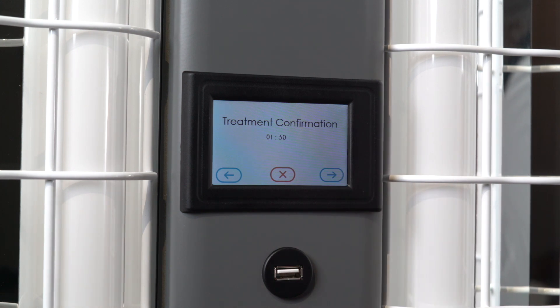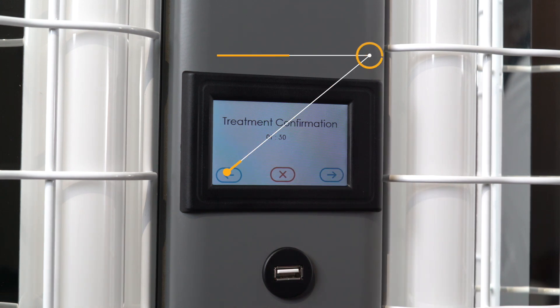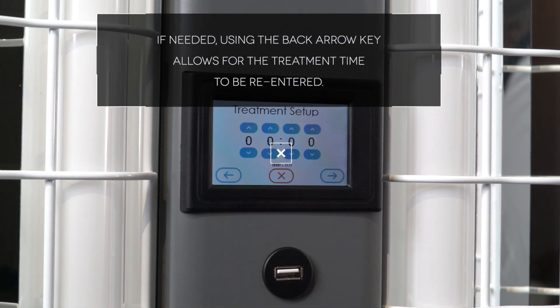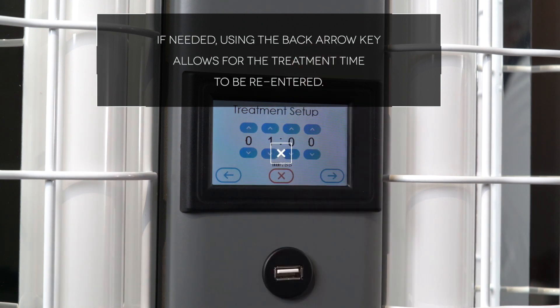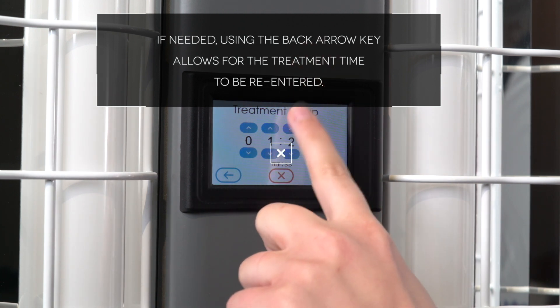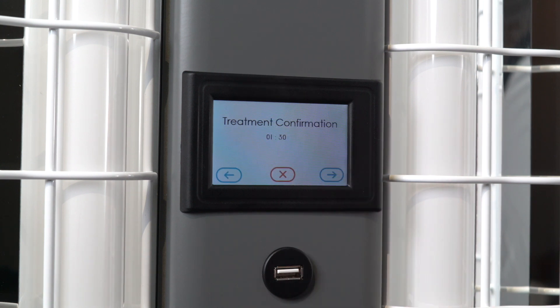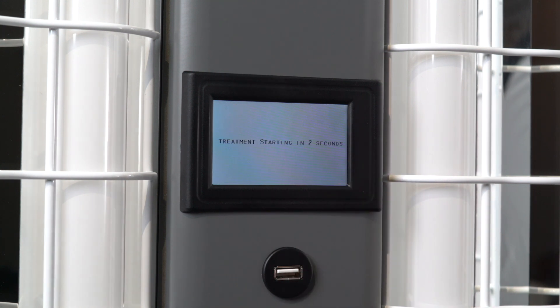Verify that the treatment time entered is accurate. If an error was made, press the back arrow key to return to the time entry screen. Before beginning a treatment, remember to put on goggles and position yourself as instructed in the operator's manual. Then press the forward key to begin your treatment.